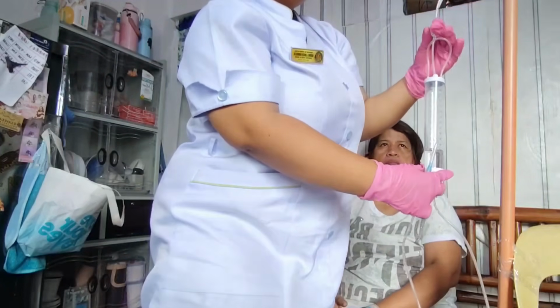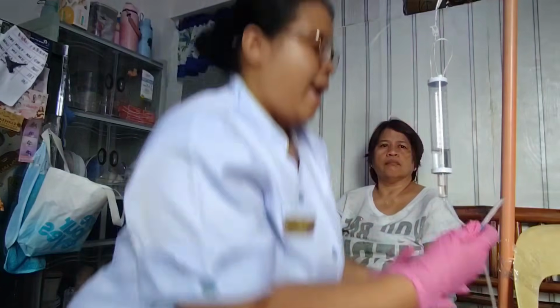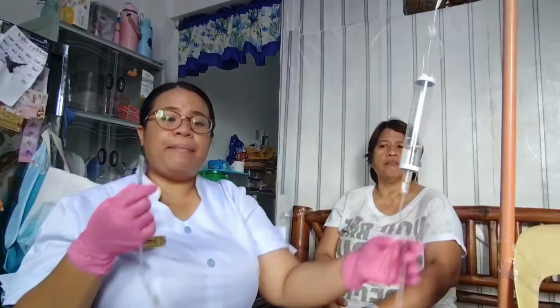Okay. So after that, we're going to close this again. And then after that, we're going to prime the tubing to remove any air bubbles. So make sure to maintain the sterility of the distal end. Let's remove the syringe first and then prime this.